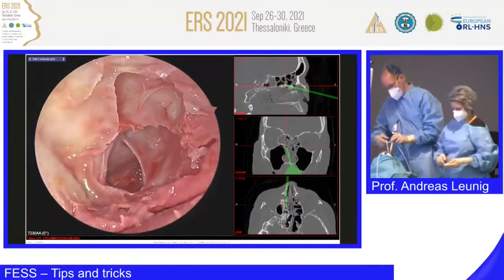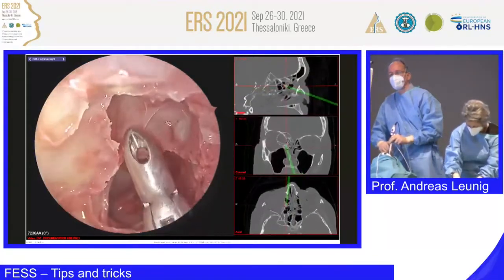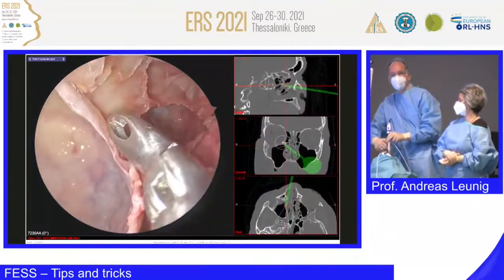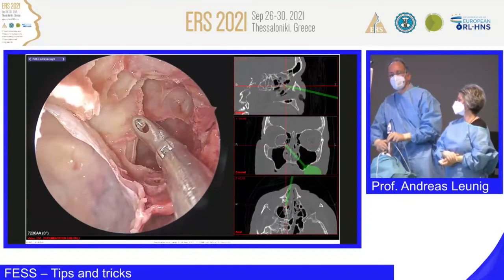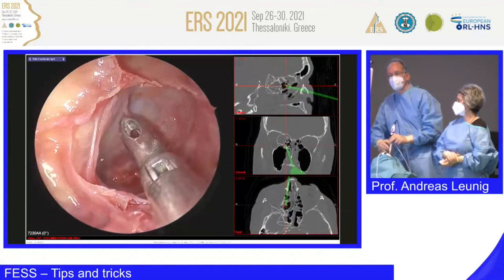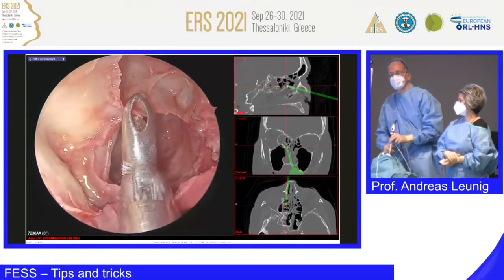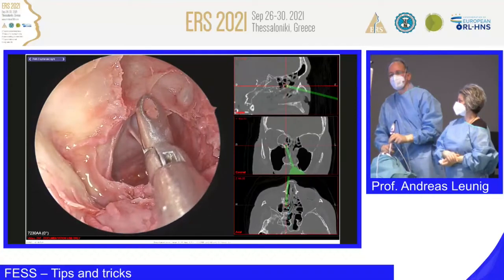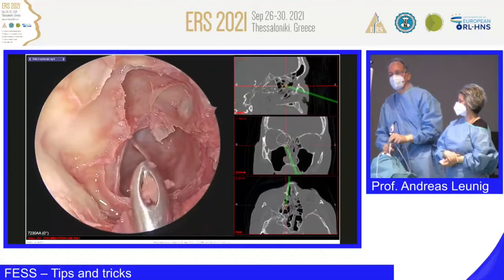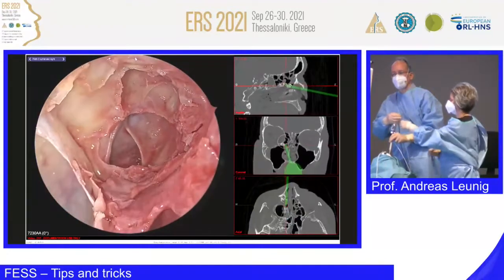So, okay. So, a thick bone here around. And here, this must be the run of, I guess, the optic nerve, going a little bit more here. And lower down, you have the internal carotid artery. And yes, there are indications to make a decompression of the orbit and the optic nerve as well. But this always has to be ruled out by the ophthalmologists and the neurosurgeons. But yes, of course, we as rhinologists, rhinosurgeons, we are doing this.